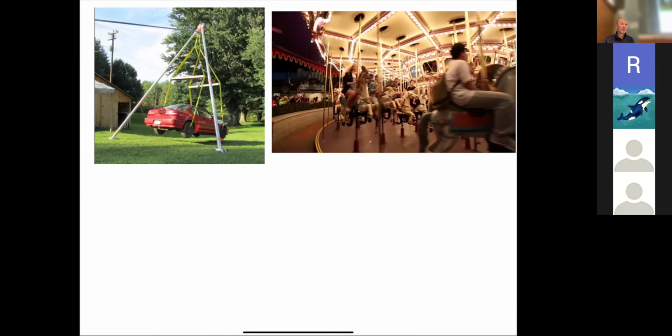Resonant frequency so that each push is additive. Yeah, right. Exactly right. Same thing when you push your friend on a swing, right? If you push them at the wrong time, you're going to break your finger, right? And if you push randomly, you're not going to move them. So you've got to push at the resonant frequency.